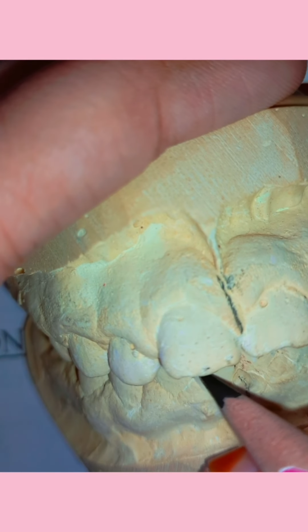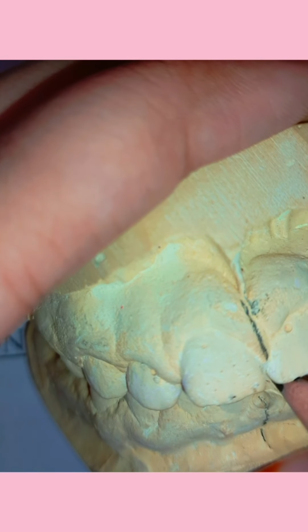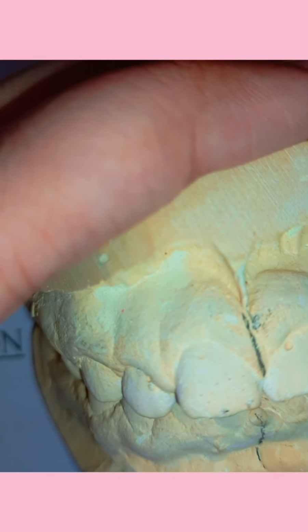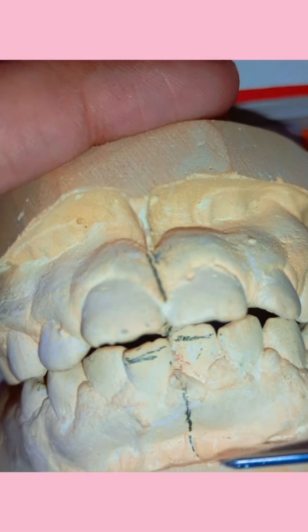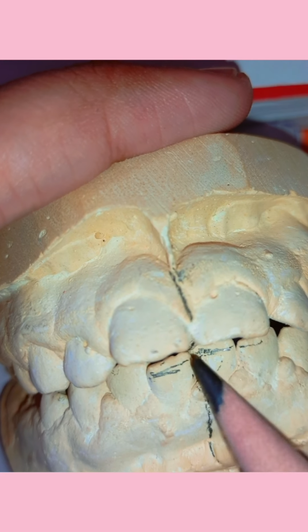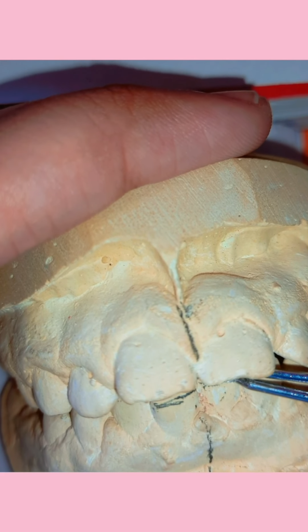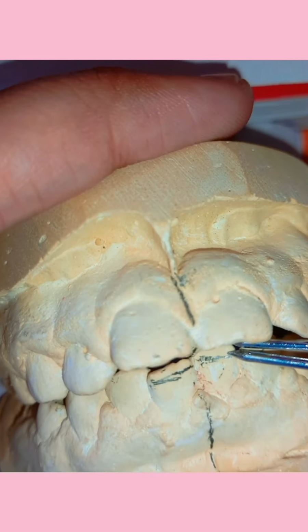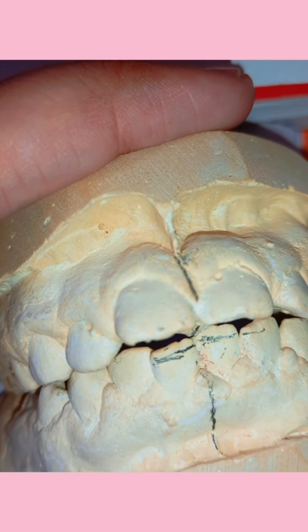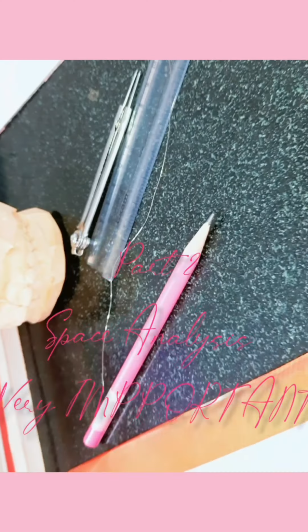Now we measure the overbite. How the upper incisors are overlapping the lower. So you keep the pencil across the maxillary incisor edge and draw the lines, and thus with the help of divider you measure it. This is again very small. Again 2 mm. So 7 mm was our overjet and overbite 2 mm. So that was all about the model analysis, guys.